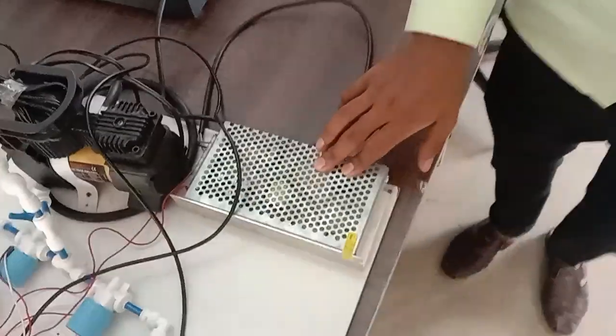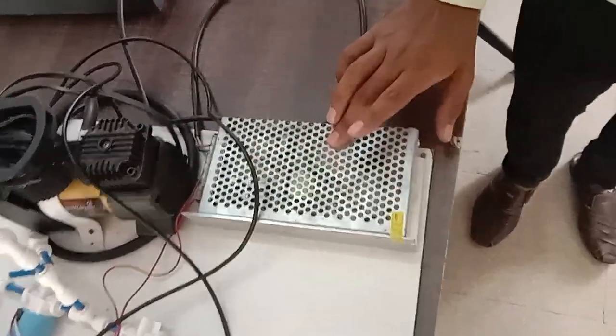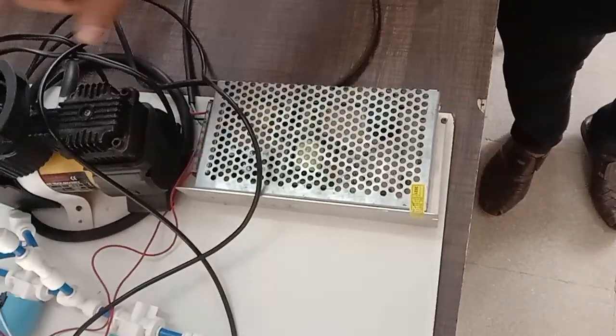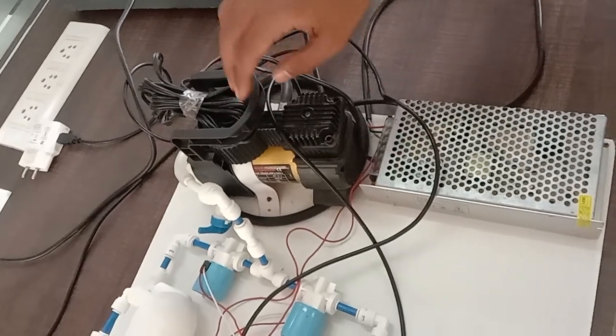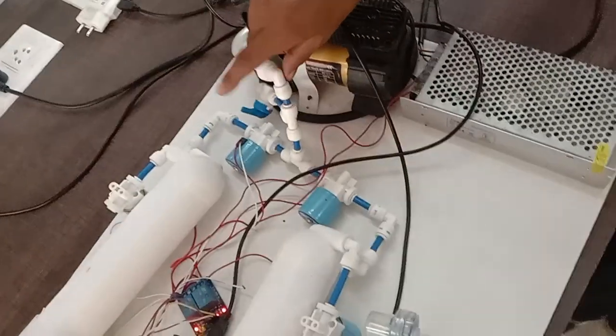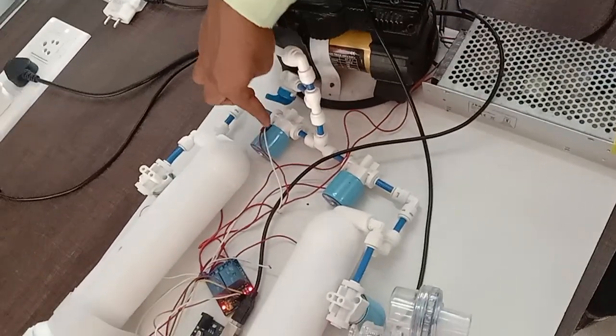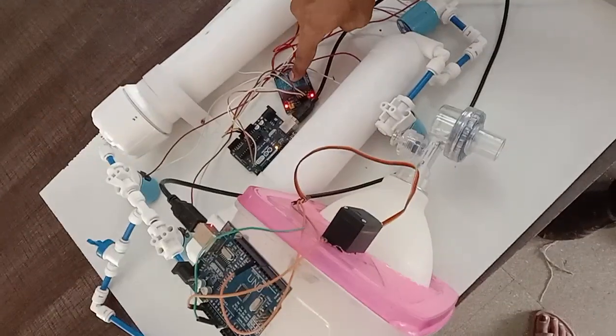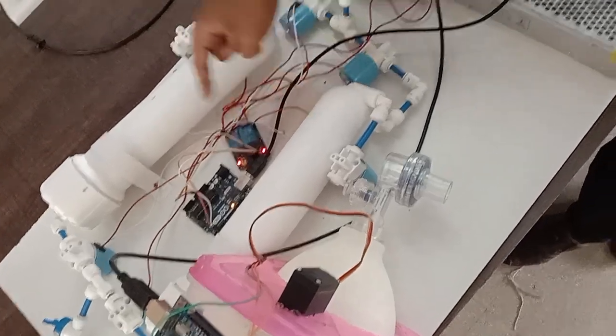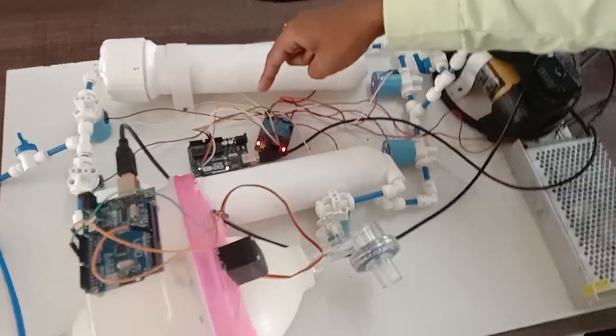So let me explain the individual components. Initially, this is the SMPS power supply and this is the compressor which we are using to produce compressed air. This air will be given through this pipe and these are all the solenoid valves which are controlled by this relay. And this relay switching is controlled by the Arduino UNO.